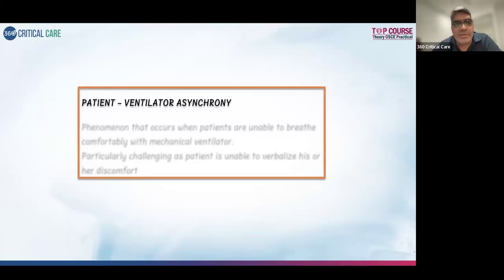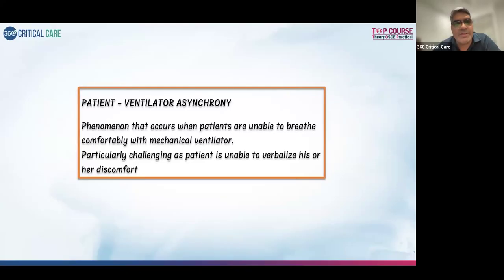Now, ventilator asynchrony, or patient-ventilator asynchrony, is a phenomenon that occurs when patients are unable to breathe comfortably while connected to a mechanical ventilator. It becomes particularly challenging as the patient is unable to verbalize his discomfort. That can lead to further patient distress, increased sedation, longer length of stay, and other complications that can happen with asynchrony.